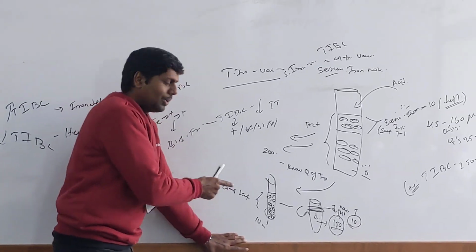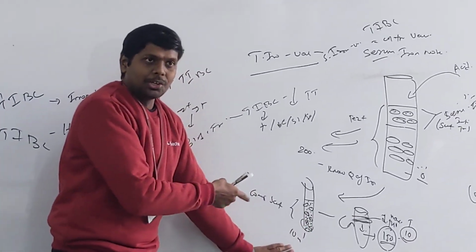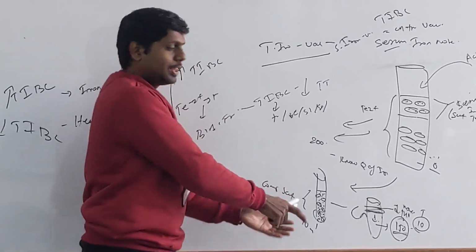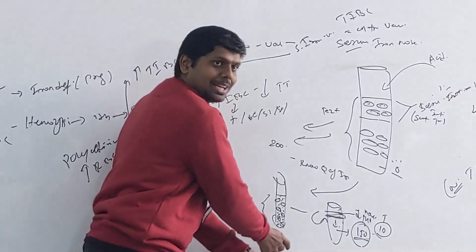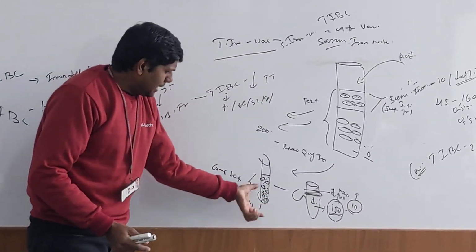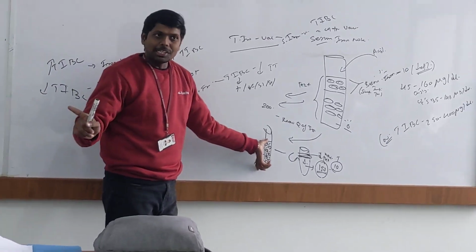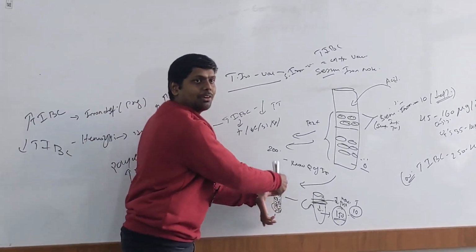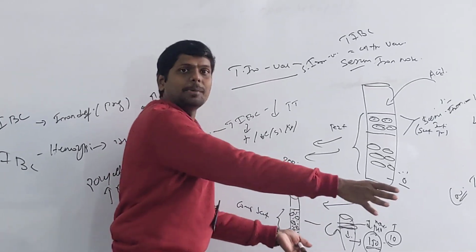Yes, sir. Now, after giving my known value to it, I waited for some time, let it take my molecules. This is called incubation. Then I did a wash step. In washing, what happened? Complete molecules have been bound. That is what the theory states. It should bind. And whatever leftover is there in the circulation, I washed it. That leftover molecules has been removed.